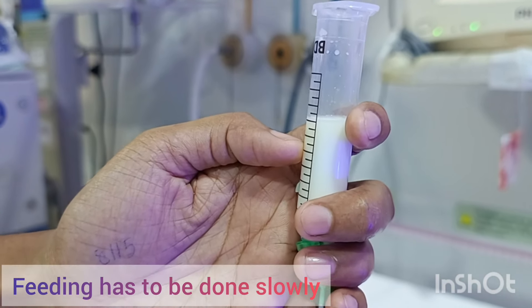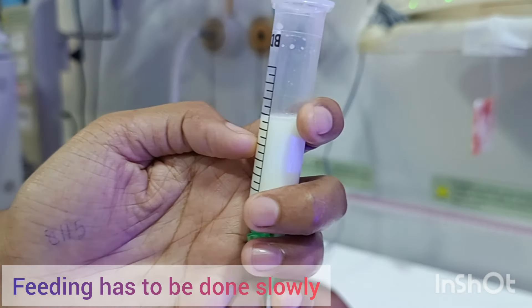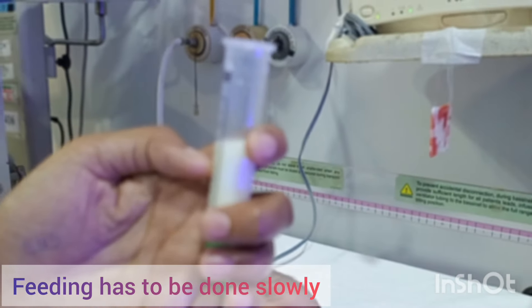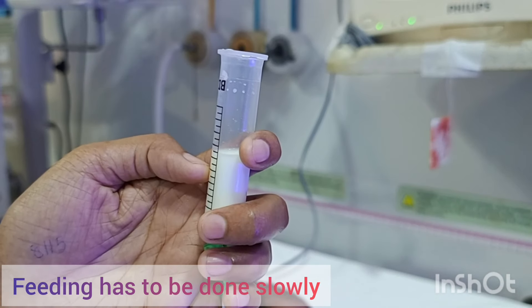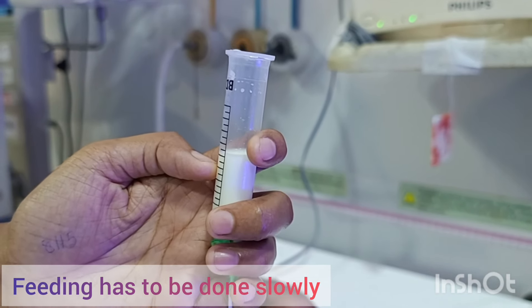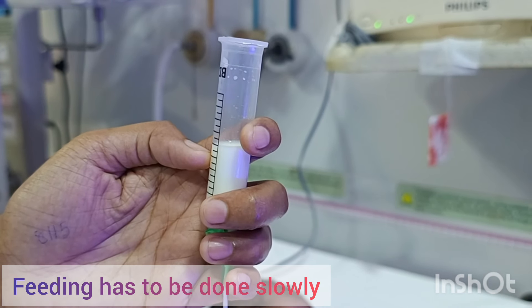You can see the milk is going very slowly. We have to give the total feed over five to seven minutes duration, so you have to be patient and monitor whether the milk is gradually going. At no point will we use any plunger to push the milk inside the baby.